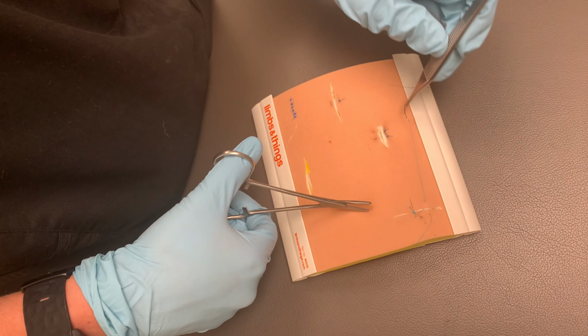She'll continue in this pattern, halving each space until the sutures are approximately equidistant from each other as they are wide, so approximately 1 to 3 millimeters between each suture.